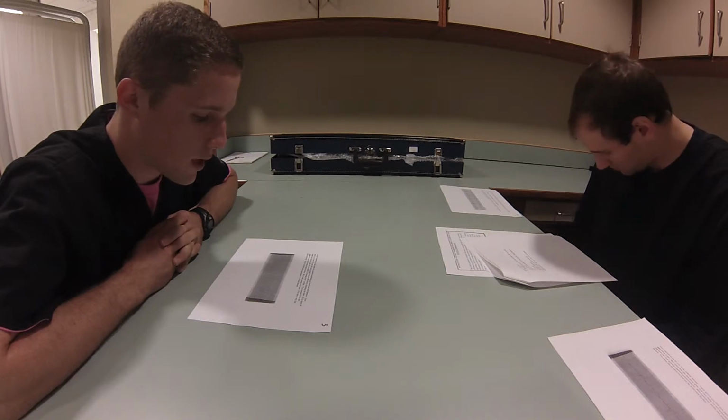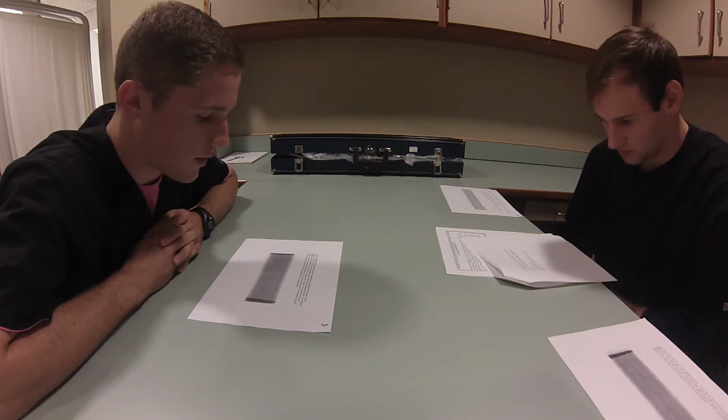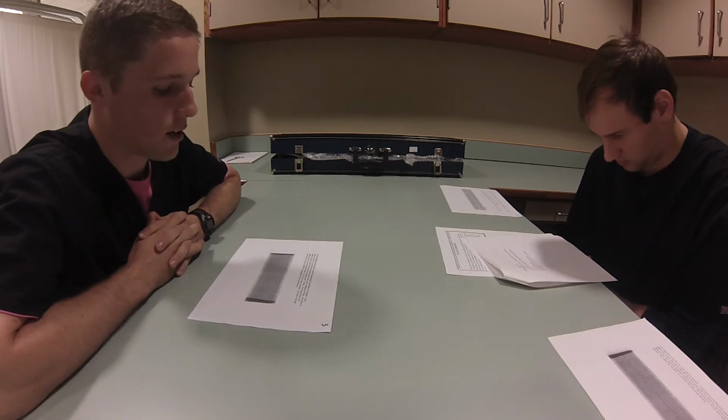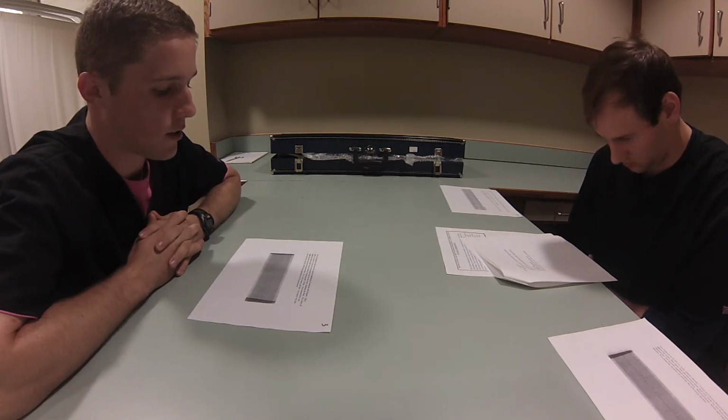He is cool, sweaty, and pale. You note a very fast and weak pulse. His blood pressure is 80/40 and respirations are 36 and labored. I'm going to connect my patient to the monitor. I'm going to apply 15 liters of oxygen on a non-rebreather. I'm going to establish IV access. And since my patient is unstable, I'm going to go straight to synchronized cardioversion at 120 joules and transport.